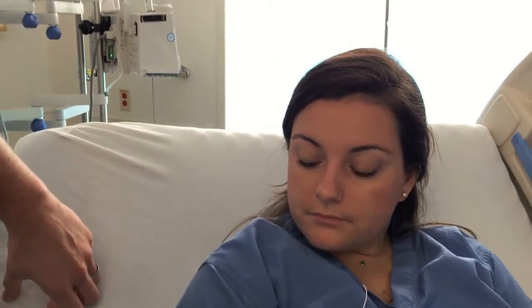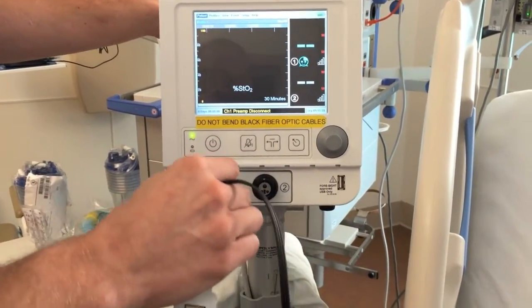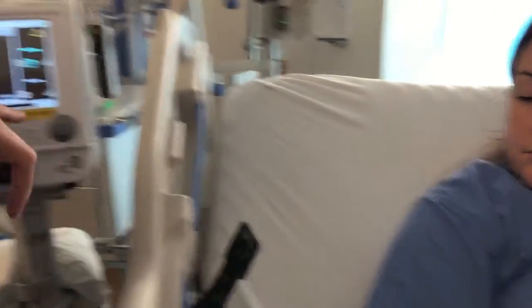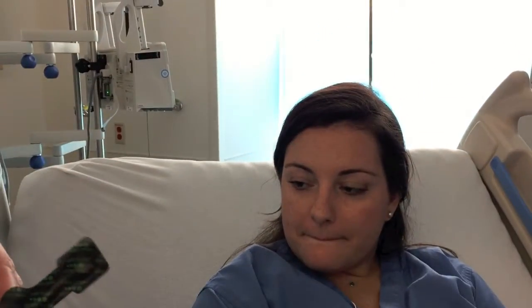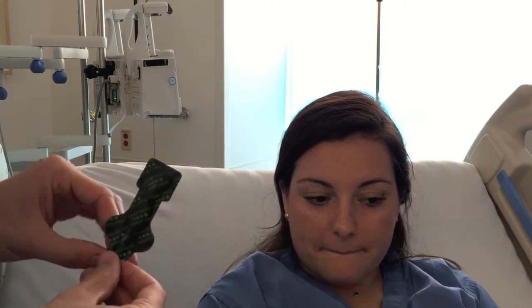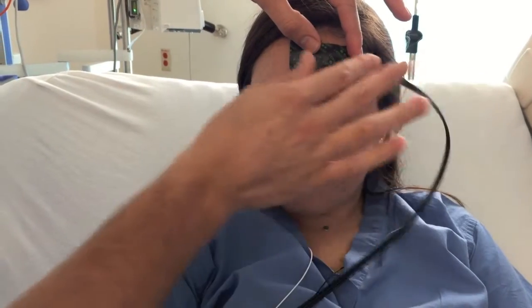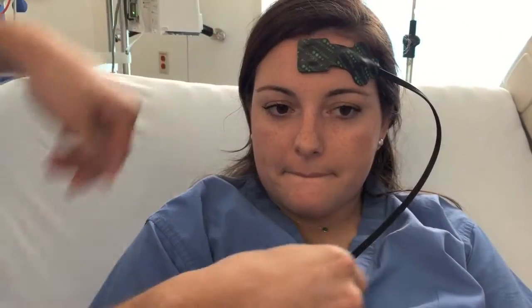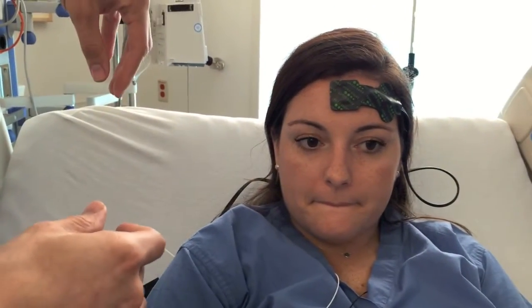Connect the sensor into the black cable itself and leave it in the bed for a moment. Make sure the cable goes up to the monitor and is connected tightly — if it's disconnected just push it in and you'll hear it click. Once you connect the sensor it'll ask you to make a connection, but first we want to connect it to our patient. We said we'll typically use the left brain, so place the sensor about a finger width above the eyebrow. If needed, you can put a Tegaderm down first to protect the skin, which also helps the adhesive last longer.